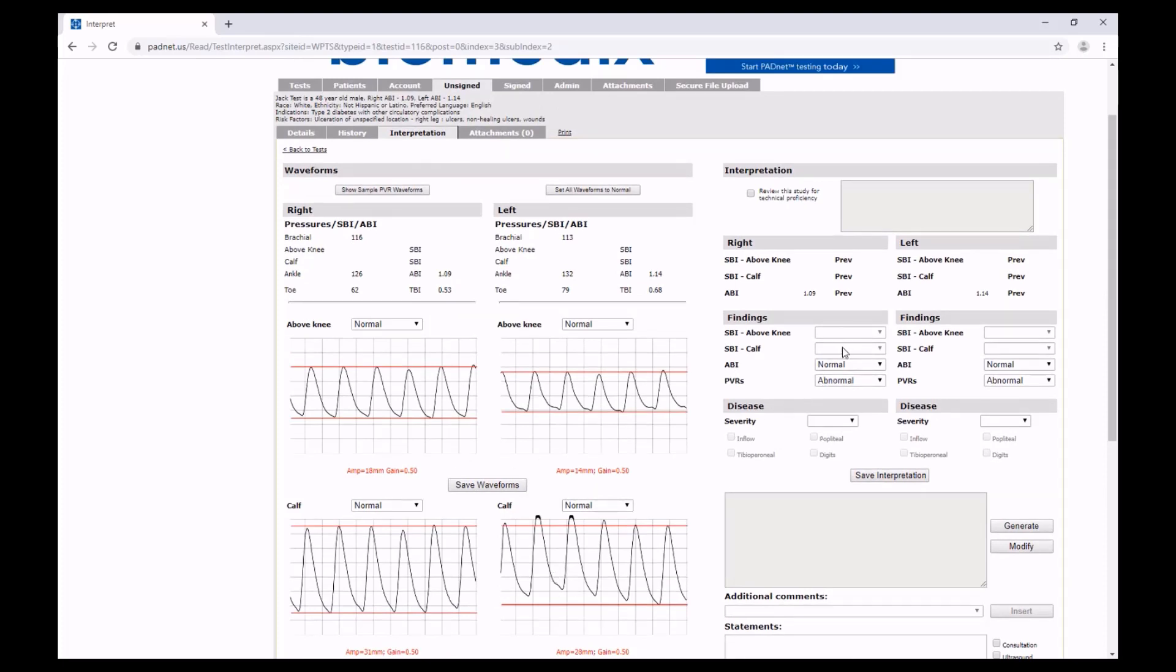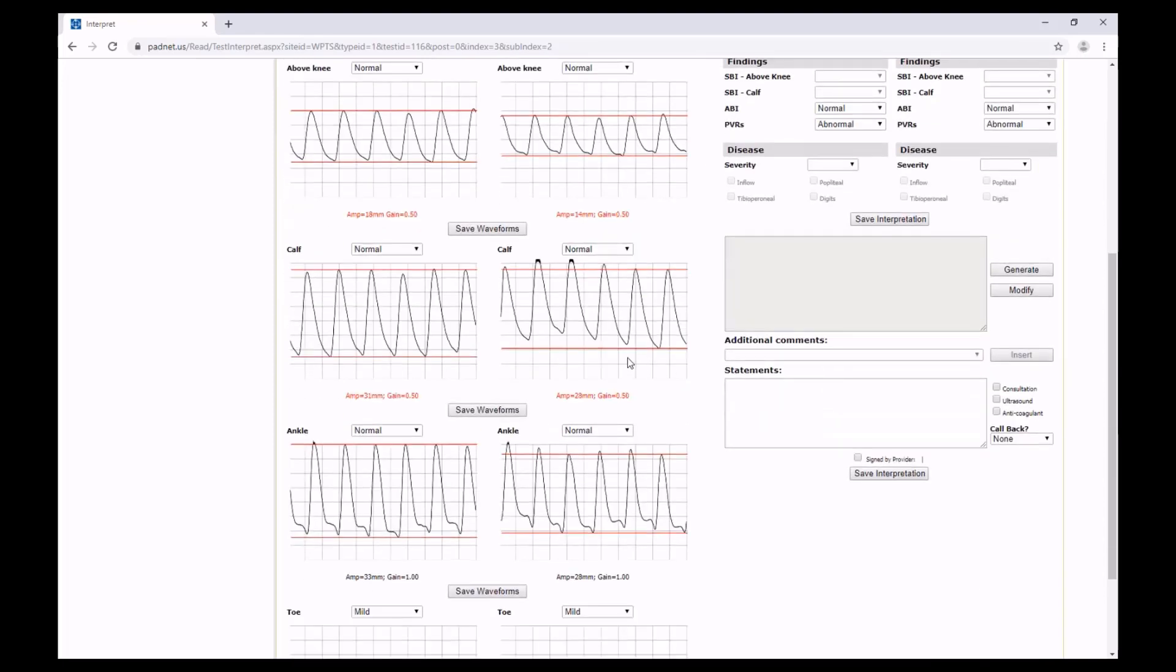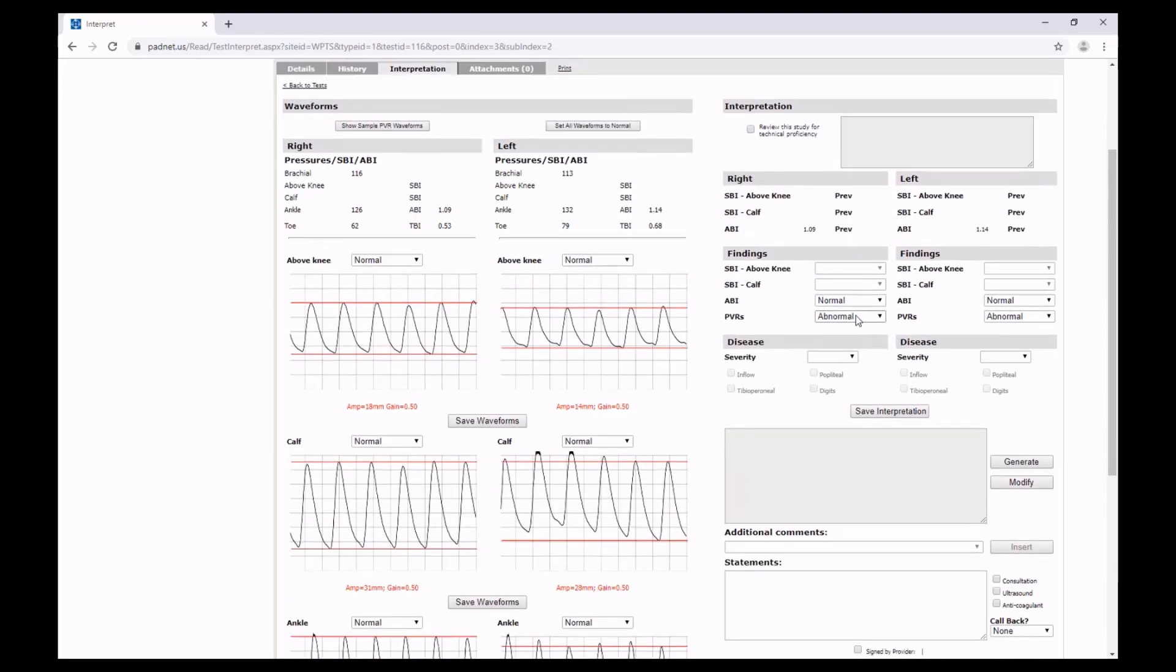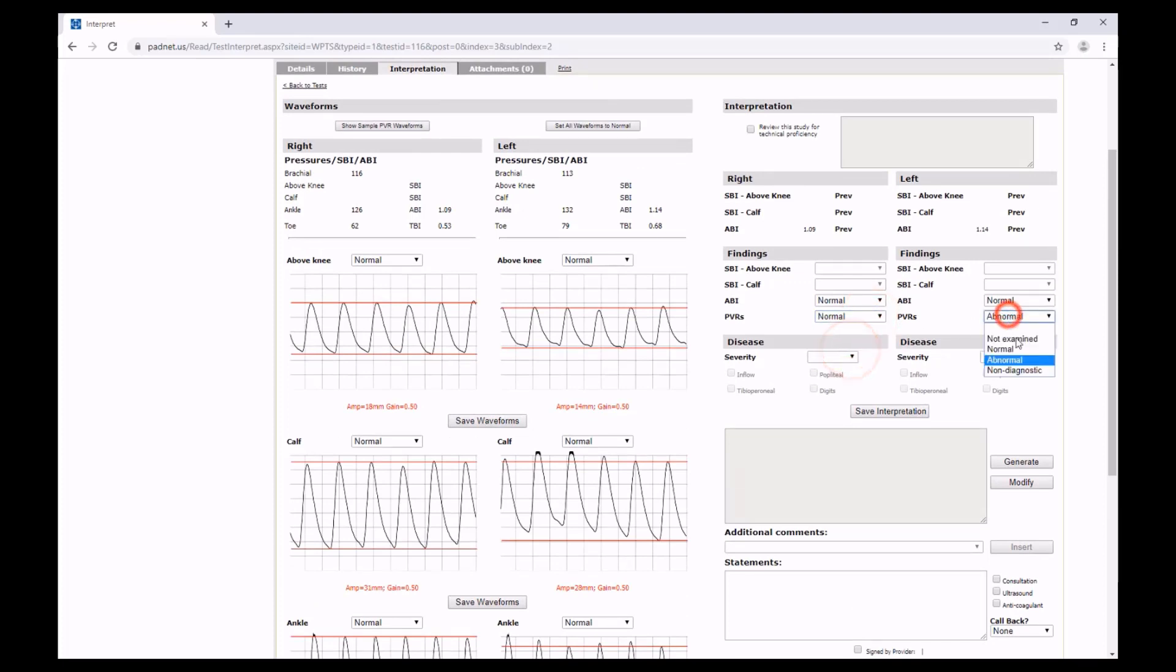Once we've selected those waveforms, we have the option to edit our brachial indexes. Our ABIs are both within our range of 1 to 1.4, so we will leave them as normal. Our PVRs on a whole are generally normal, with the exception of some mildly abnormal toe PVRs. So we will select normal as a whole.